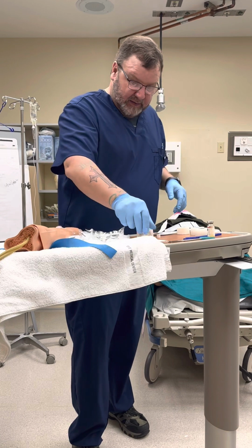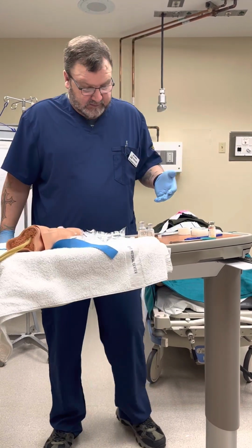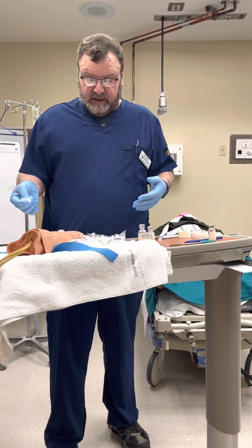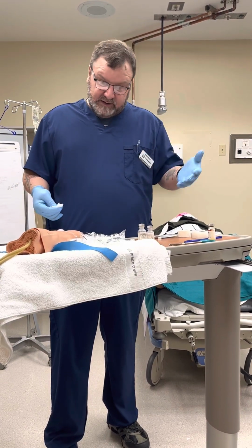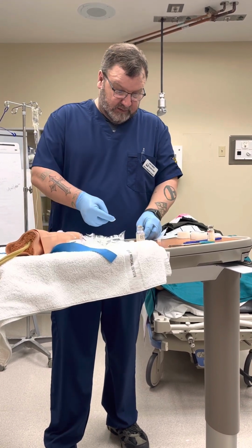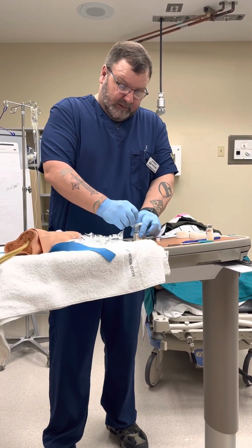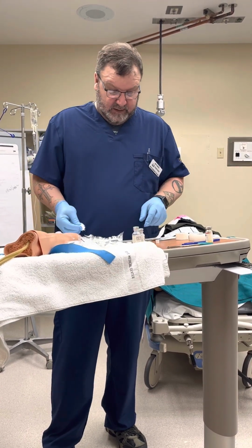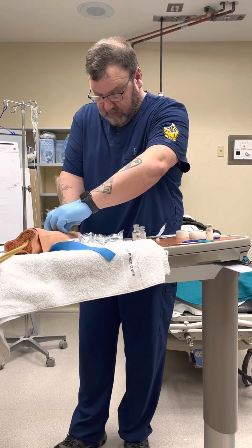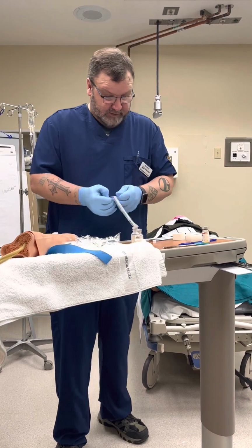So that being said, I'm going to do my 3 checks of medication, check my patient ID, make sure the patient understands the procedure, check my allergies, make sure she doesn't have allergies. There's no latex, no penicillin, those are her allergies. I'm going to clean with alcohol the tops of my containers, take another swab, clean my medication port. I'm going to remove my appropriate syringe.